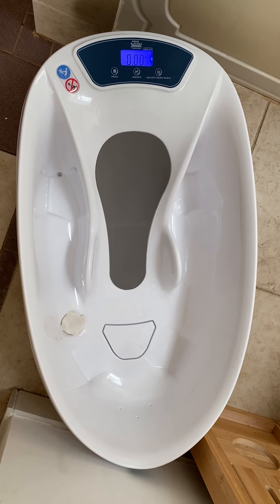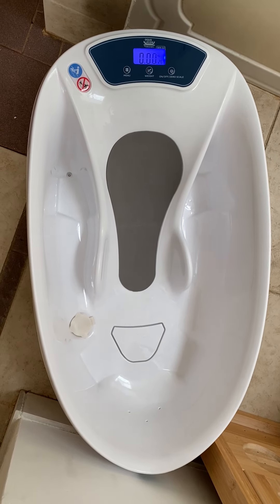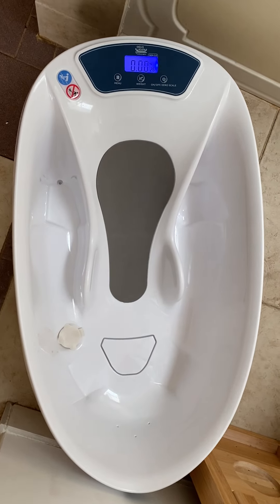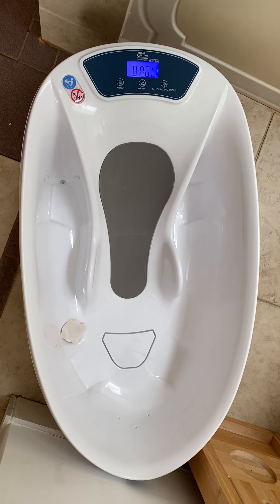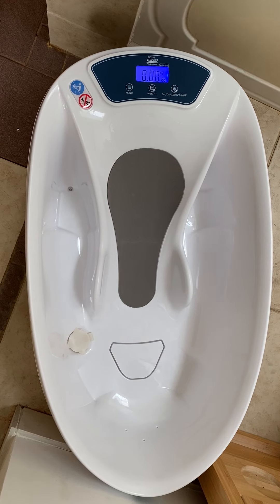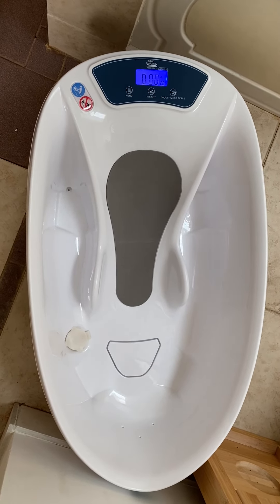Hi everyone, today I want to show you this amazing baby scale called Aqua Scale from Baby Patent. This is the perfect solution for parents who want to keep track of the baby's weight to make sure of healthy growth. You can weigh the baby with or without water.